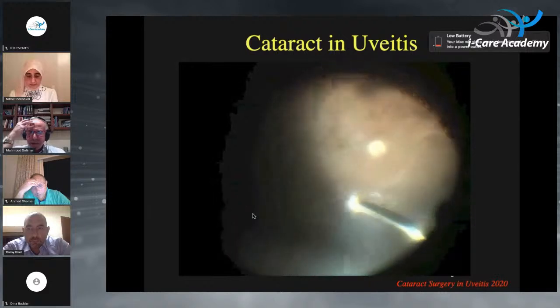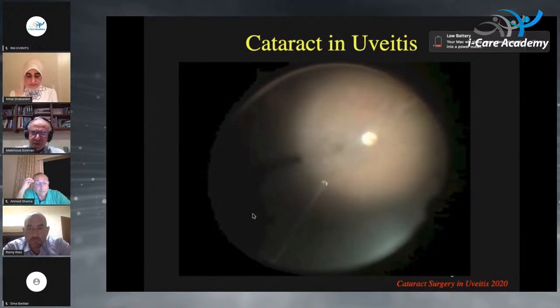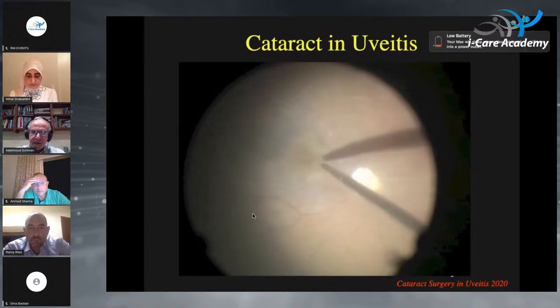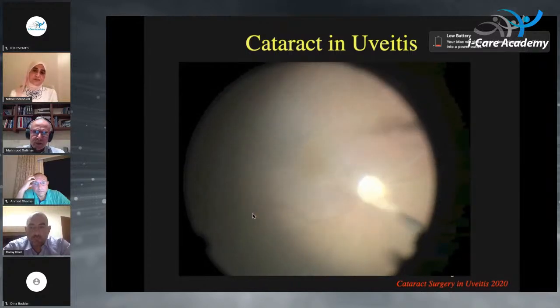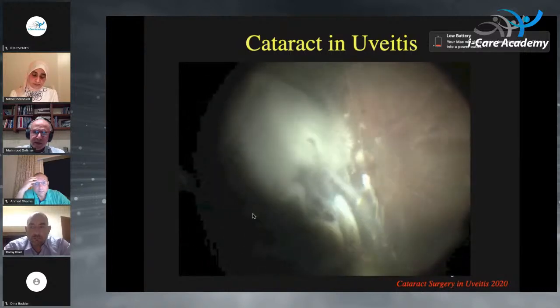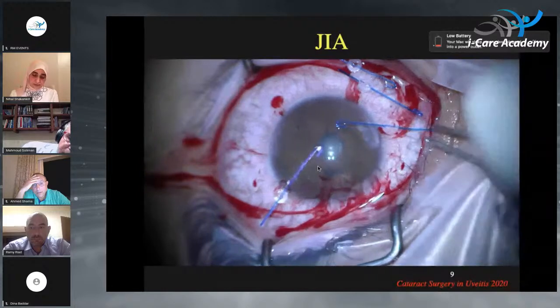In this patient as well, you see the occlusive vasculitis, and this was a single-eyed patient who actually did well after surgery, although with time the process of Behçet's inflammation ended up with extremely poor vision. When you do a proper pars plana vitrectomy, you're able to remove epiretinal membranes and leave the patient with triamcinolone.